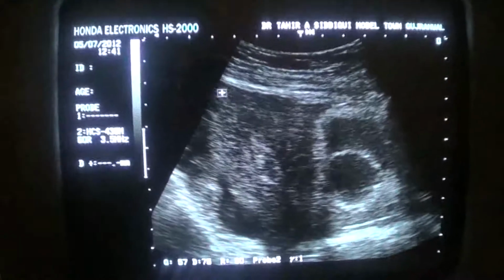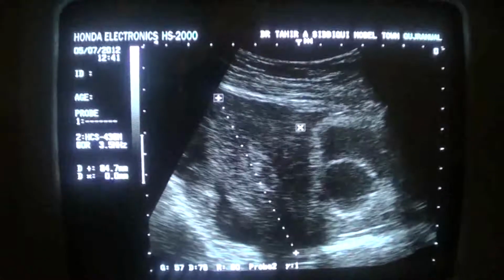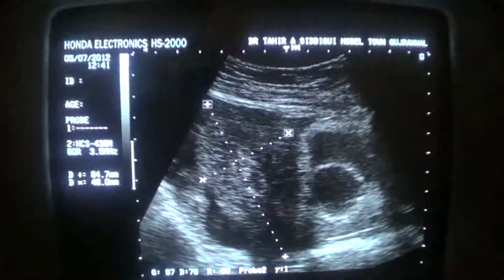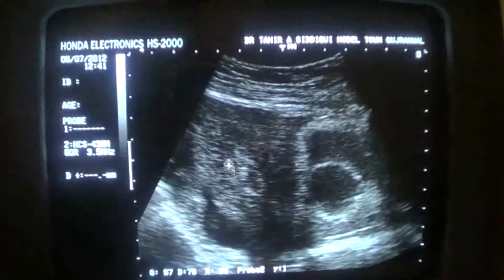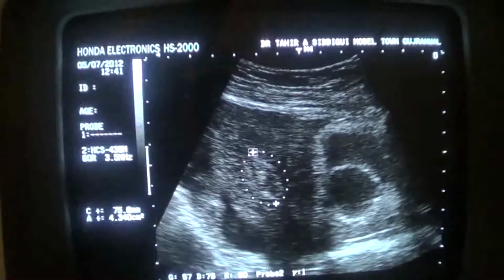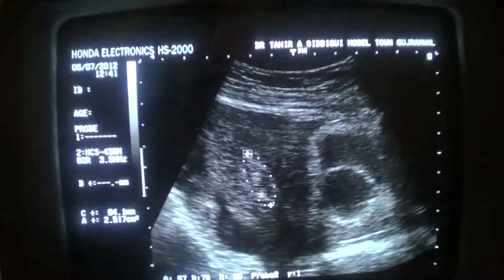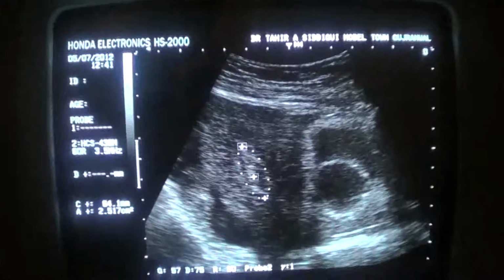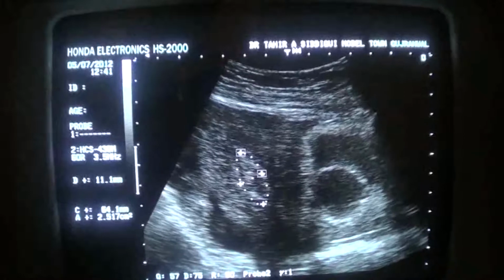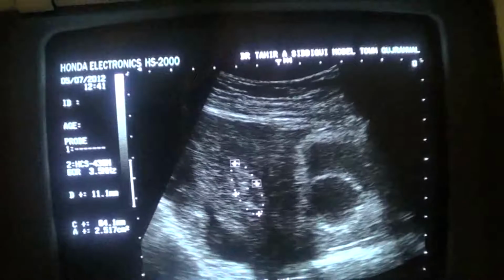This is the uterine outline. In longitudinal section it measures 8.4 centimeters, and in anterior-posterior diameter it measures 4.6 centimeters. It is not enlarged. Now this is the endometrial canal, in which you can see different strength internal echoes, consistent with bleed. The endometrial canal is not dilated, measures 11.1 millimeters, normal is up to 13.